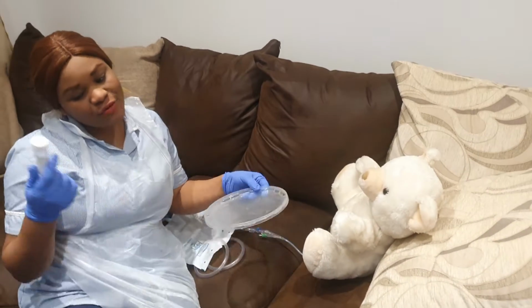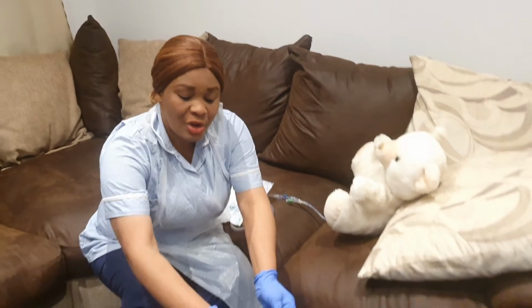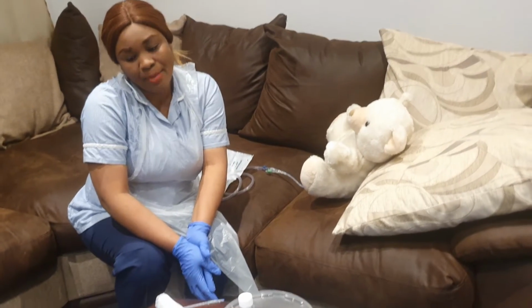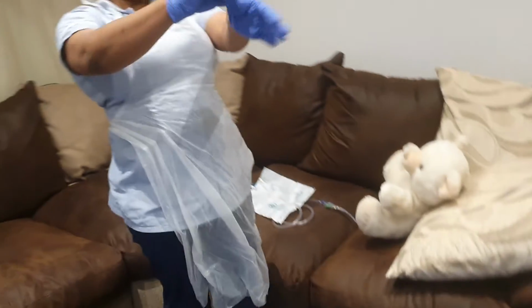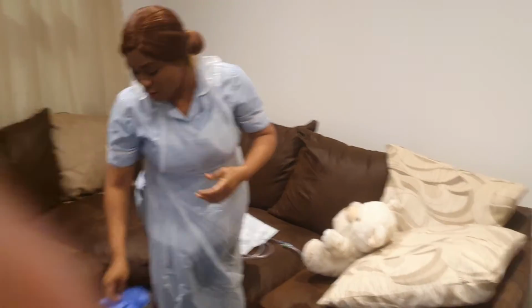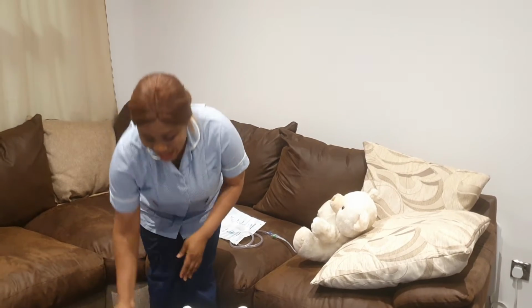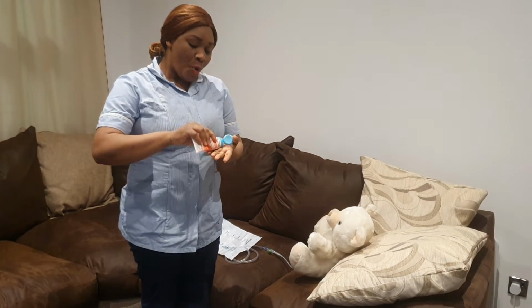All right. So guys, you've collected your sample of urine. You are going to verbalize to the assessor that you're going to label it, and send it off to the lab. You are going to take off your apron. You are going to take off your gloves, and all goes into the clinical waste. You are going to do your hand hygiene and make sure you clean every equipment used and ready for the next use.